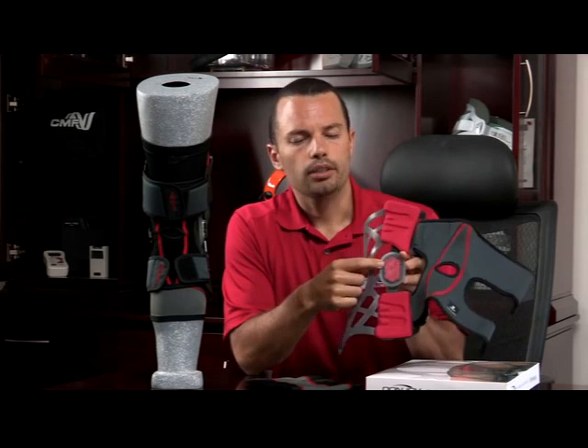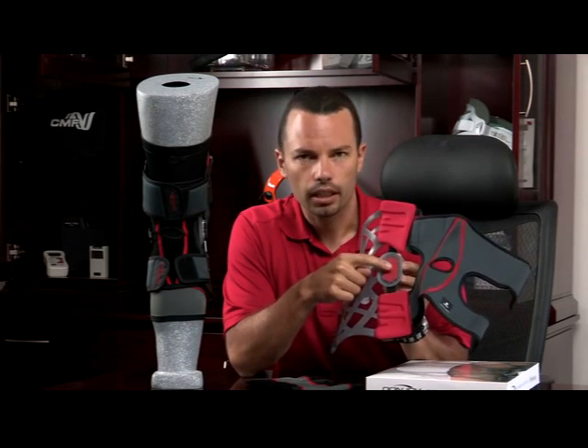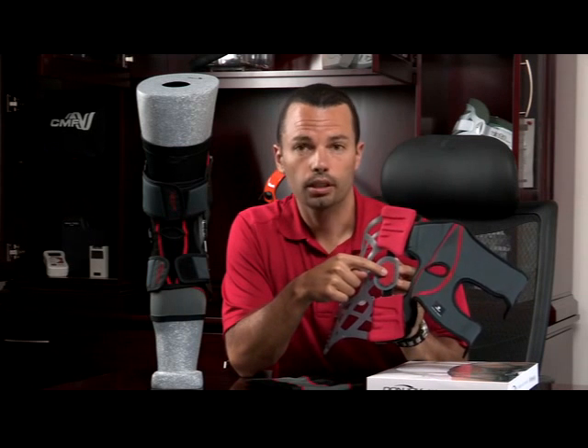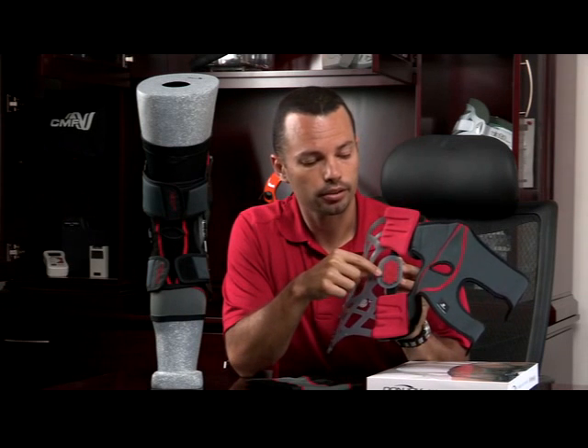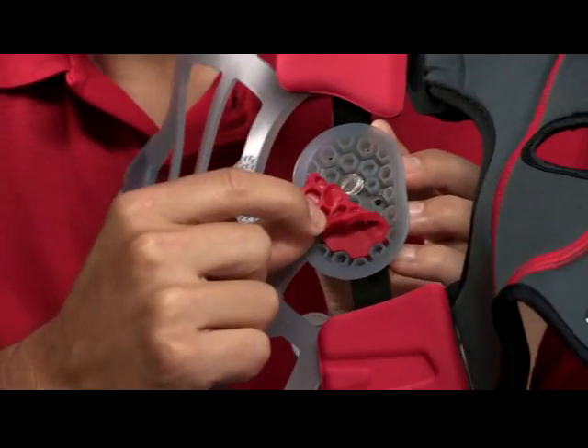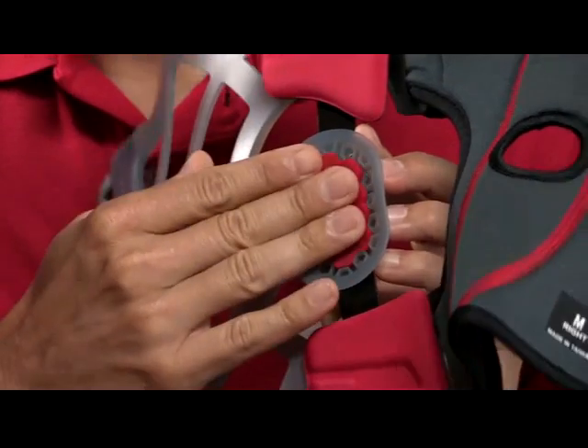This is an integrated silicone condyle pad. What this condyle pad does is it pushes on the side of your knee to help you get pain relief from your osteoarthritis. It has little hex designs and that creates little air pockets for a nice comfortable support.